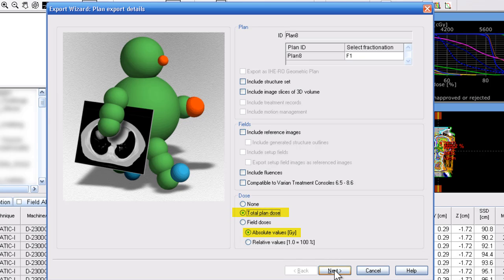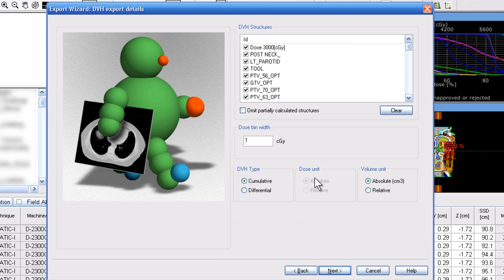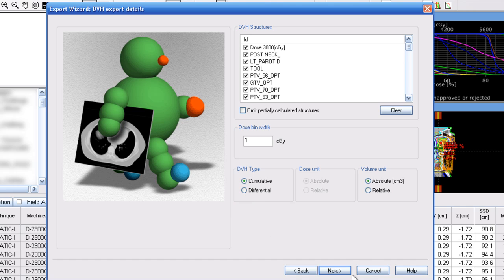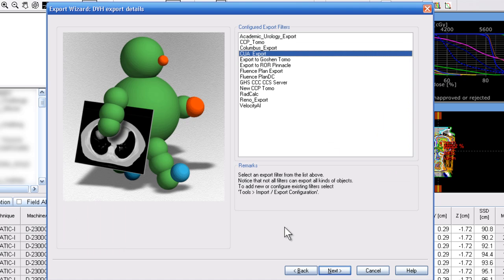Once you have that, you can click next. You will see the screen here with the DVH export details. Typically, the default values that are shown here are sufficient. The DVH type being cumulative and the volume unit being absolute. You can select next.